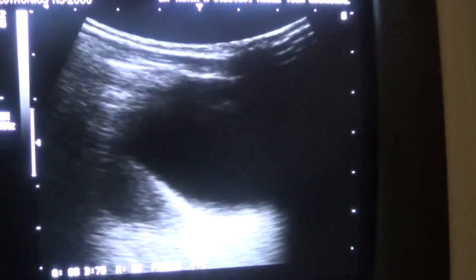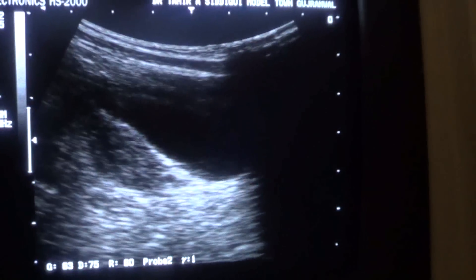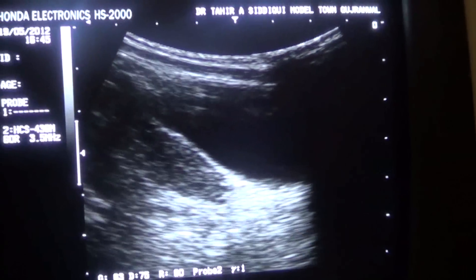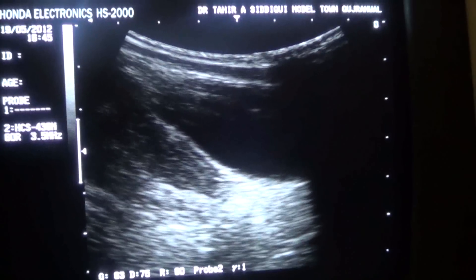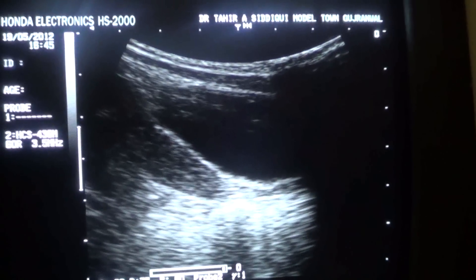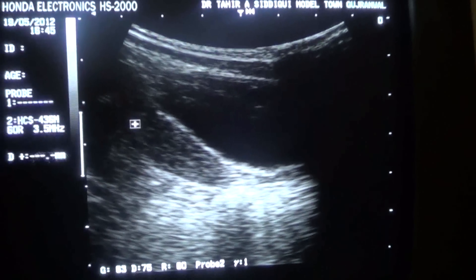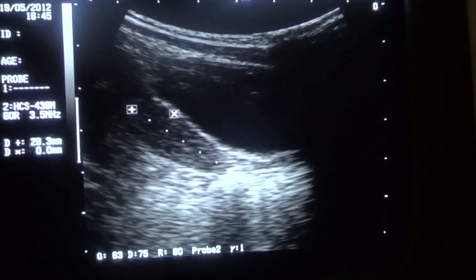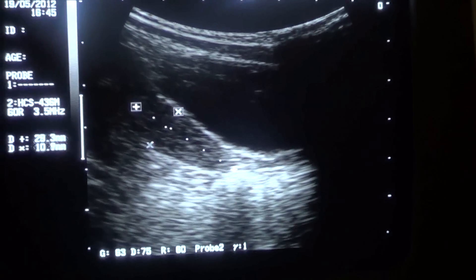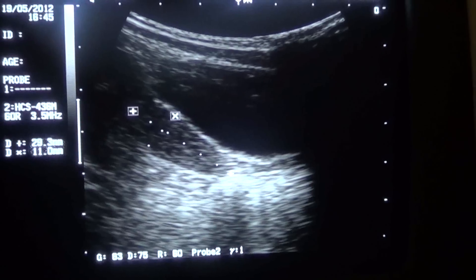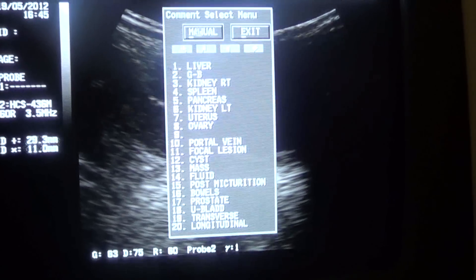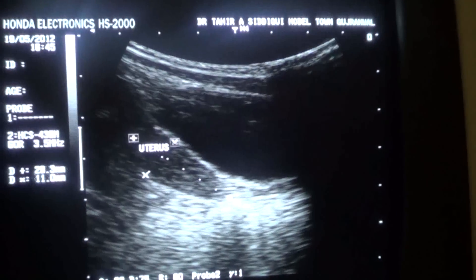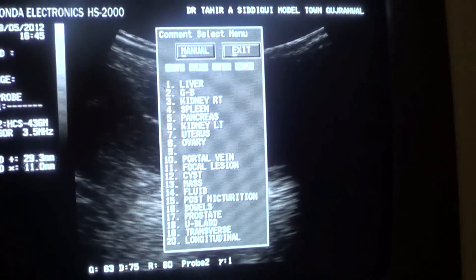Here you see the uterus of this eight-year-old girl in longitudinal section. The uterus measures 2.9 centimeters in length and 1.1 centimeters in the posterior diameter. This is a normal uterus of an eight-year-old girl.